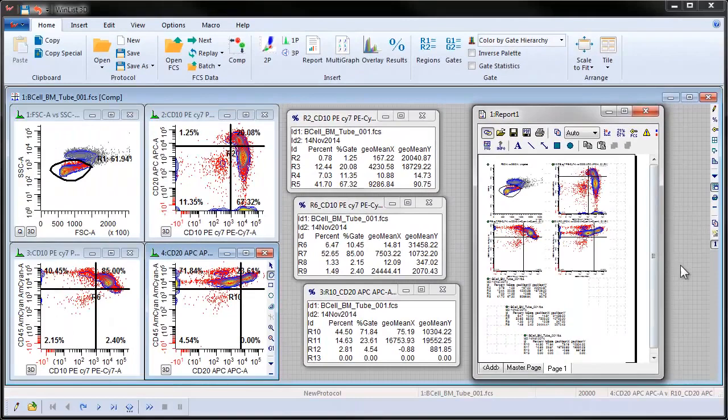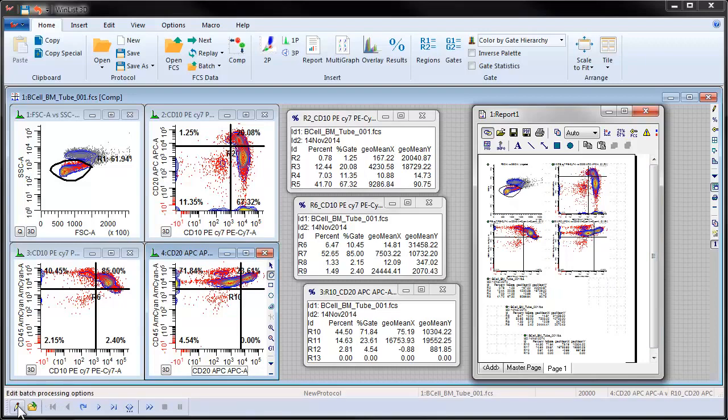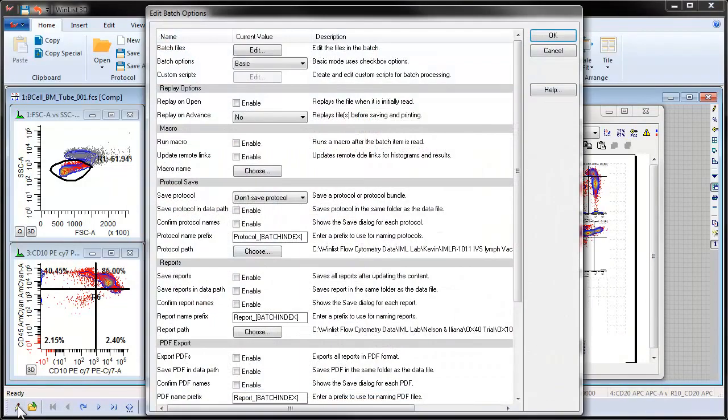WinList has created a batch of files to analyze in the batch processing toolbar, which appears at the bottom left of the workspace. Click the Edit button to display the Edit Batch Options dialog to see the various options that are available during batch processing.